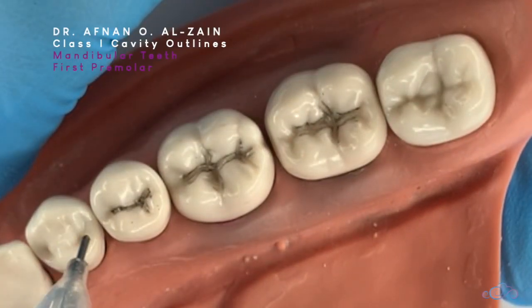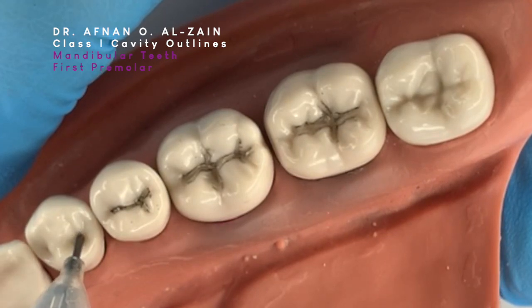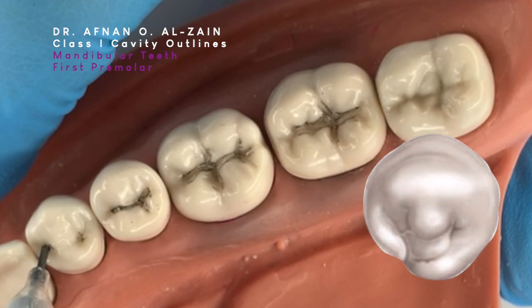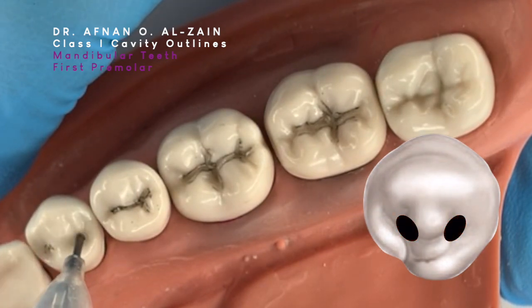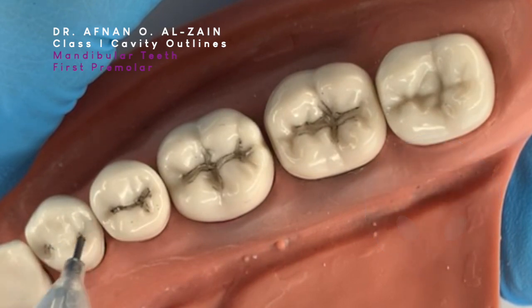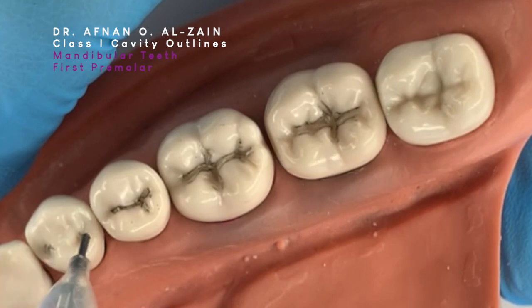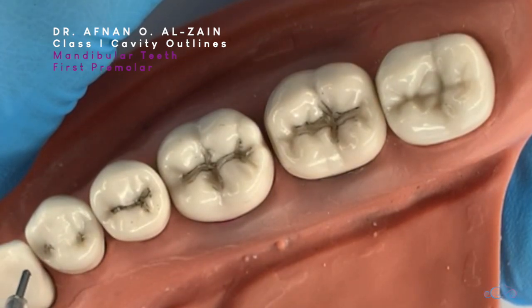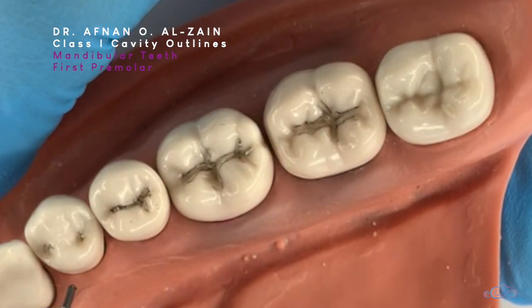Moving on to the first premolar, or tooth number four. The outline is two pits, so we preserve the ridge — we also call them 'snake eyes' because there is a ridge in the middle. According to your school, if your school mentions they want you to join both pits together to do a straight line, you follow your school's instructions. This is the outline for mandibular teeth.